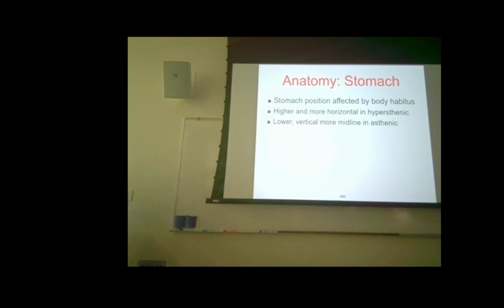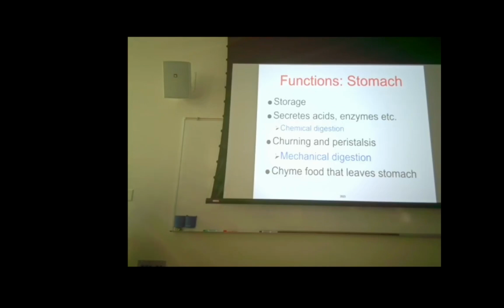So that's going to affect your positioning. Right? We've got some specific projections for different body habitus. If you have a hypersthenic patient, we may add a view. If we have an asthenic patient, we may have to position way wide and way low.